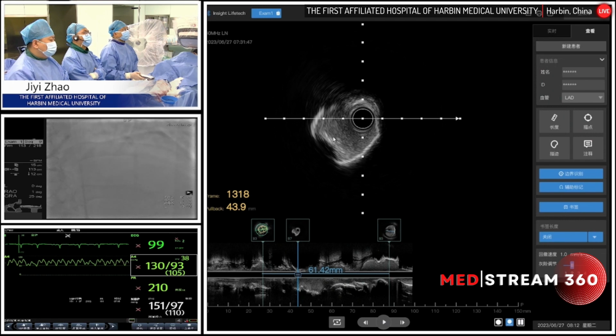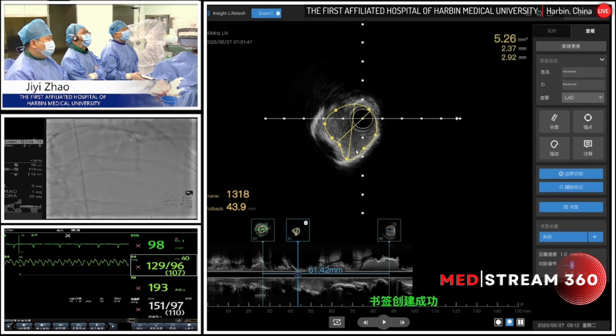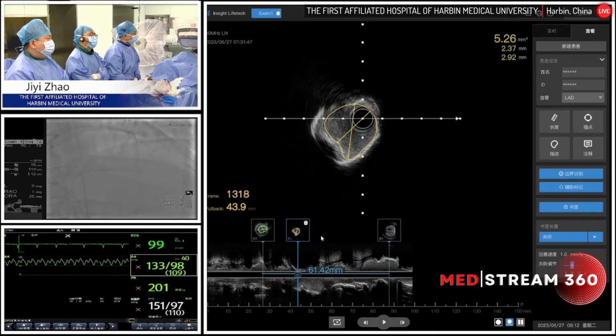But we can see the diameter of the vessel is also relatively large. For me, this is a pain spot in this patient, because if we use rota for this patient, I think that a 2-millimeter burr doesn't touch the wall very well. However, a 5.3 millimeter square for the proximal LAD doesn't meet the cutoff value for a good prognosis.